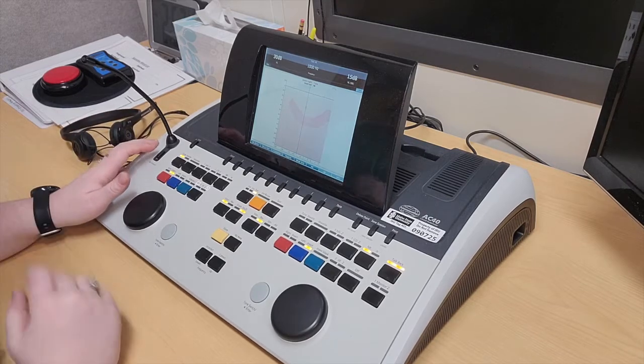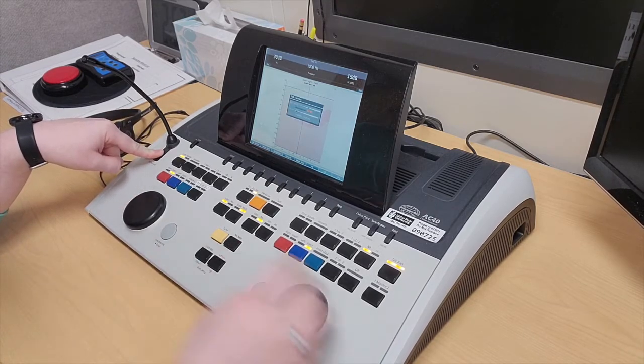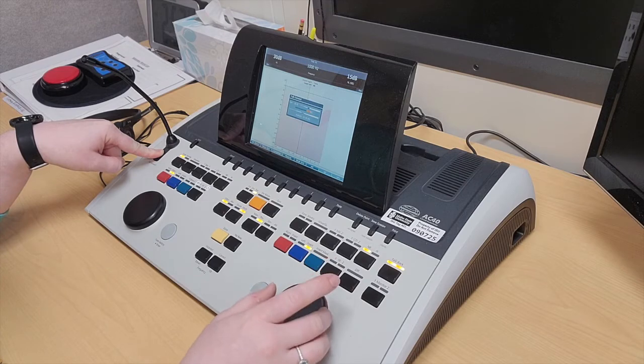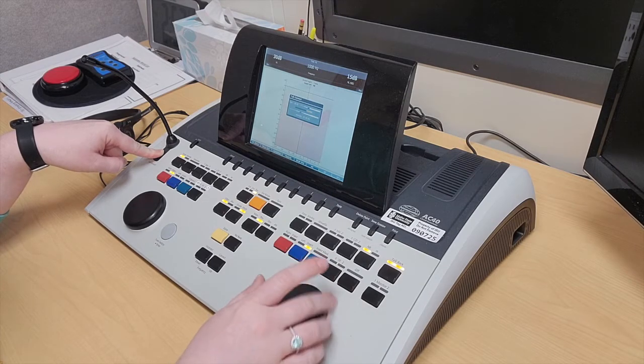To adjust the level, you would press and hold the talk forward button, and then you can adjust the intensity by moving this wheel here.